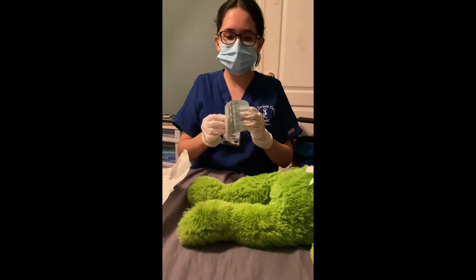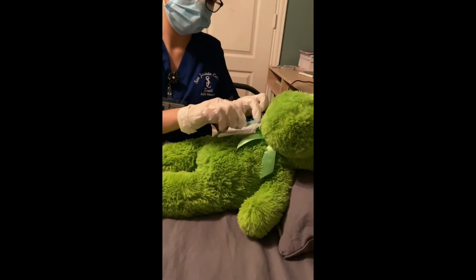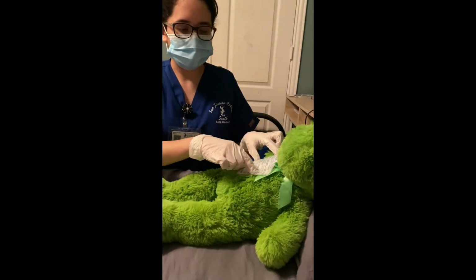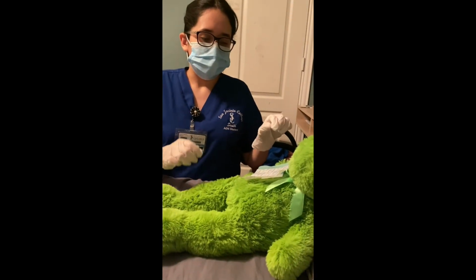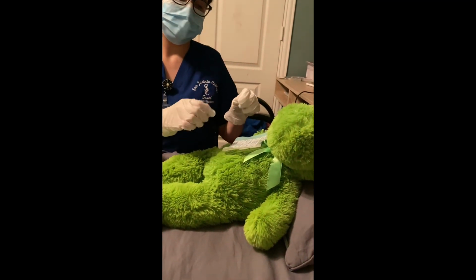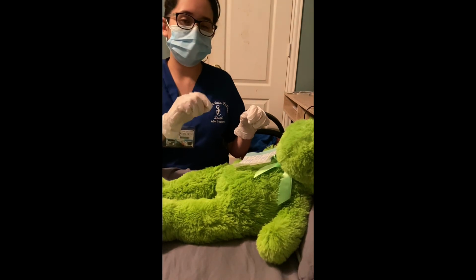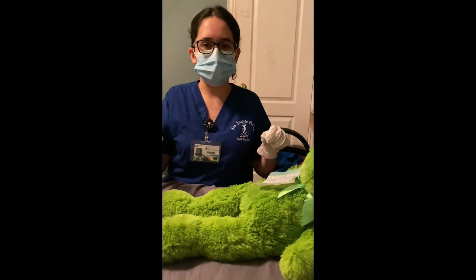Okay, so for the purpose of this video, I'm not actually going to open it, but I would open it and then apply it to the patient's site. And then make sure that there's no openings or no air bubbles under the dressing. Okay, so after we do that, we again make sure that there's no opening areas or no air bubbles under the dressing. And we're going to make sure that after we're done, the dressing includes the nurse's initials, the time, and the date that the dressing was changed, so that the next nurse knows when it's time for a new dressing change.